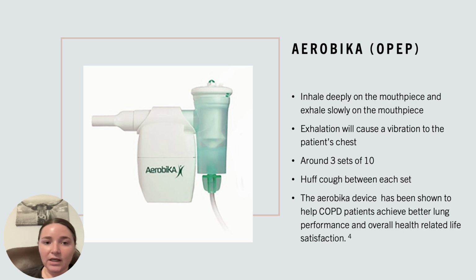Another study analyzing the efficacy of an OPEP device in COPD showed that the utilization of the Aerobika device improved airflow, which influences the patterns of concurrent prescription drug deposition in COPD patients. According to the findings of both studies, both the Aerobika device and the Acapella device can reduce length of stay in the hospital and readmission. Both of these devices are effective in clearing out secretions and improving lung function in COPD patients, and they are also used in post-exacerbation care.